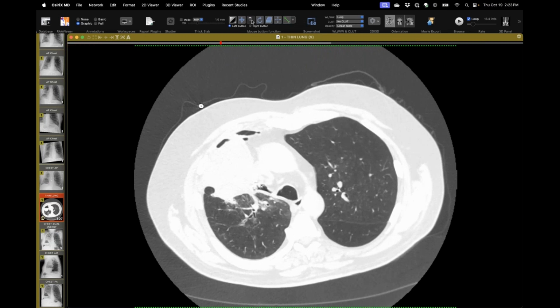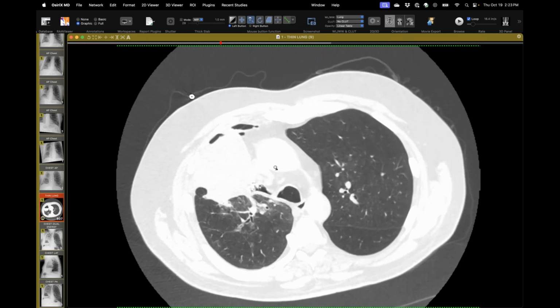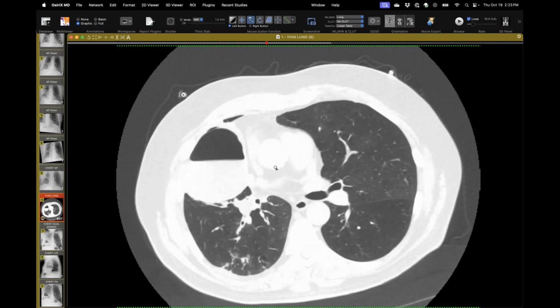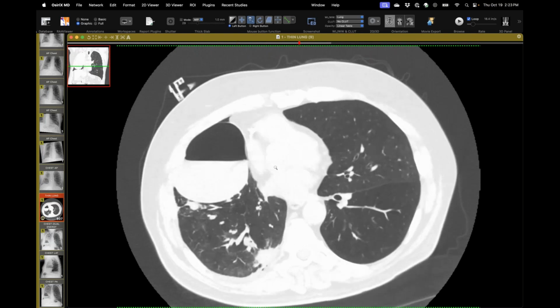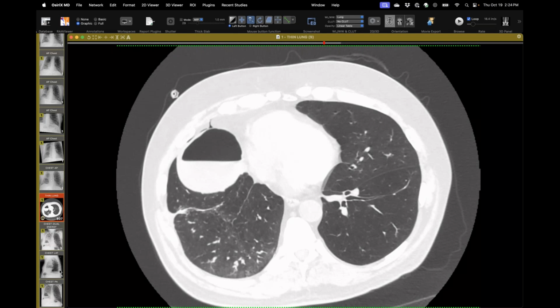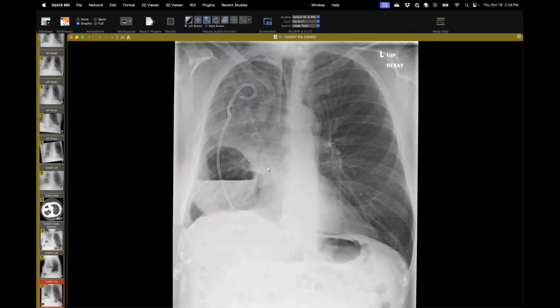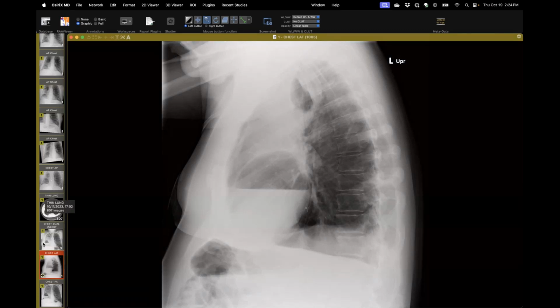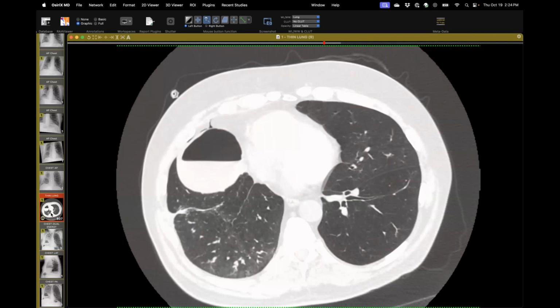So Jeff, this is in the lung. It's a pneumatocele that's in the lung. But did you say earlier that there was something in the pleural space, or did it just look as if it was in the pleural space? I'm sorry, yeah, it looked like it was pleural there. My bad. He's got this pneumothorax, but it's kind of rounded here, so you wonder about the lung, but it appeared rather quickly. And then he's got this big one up here as well.